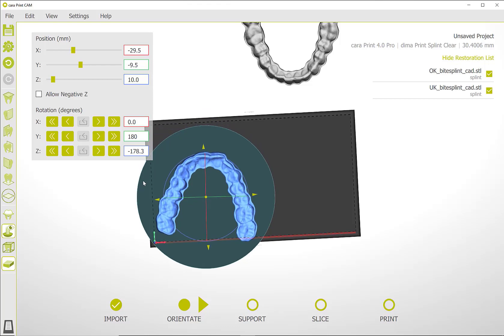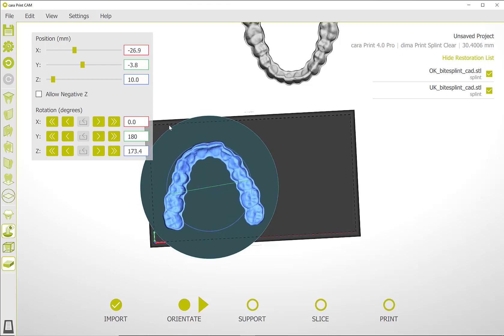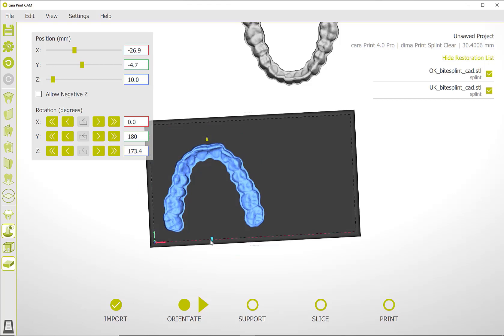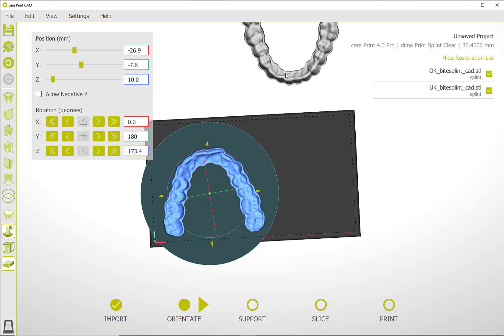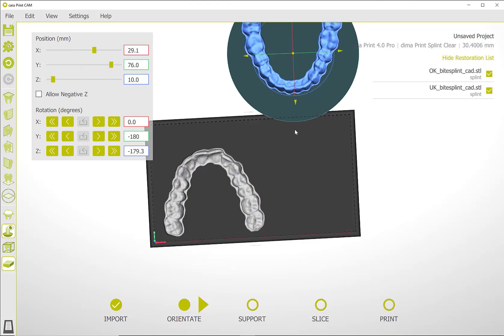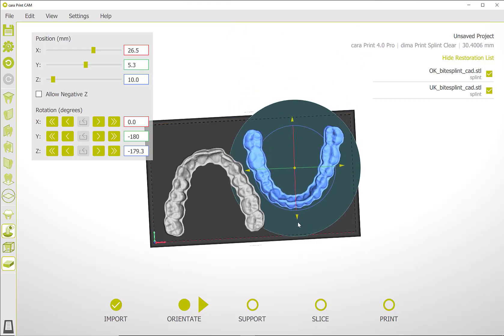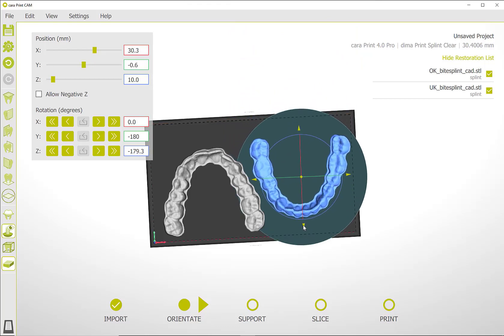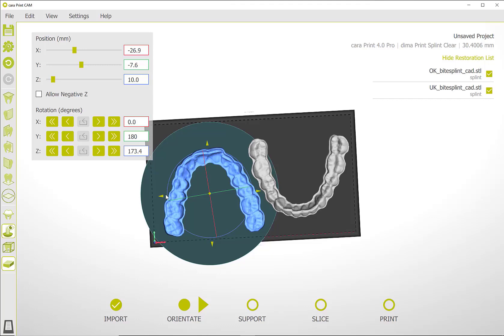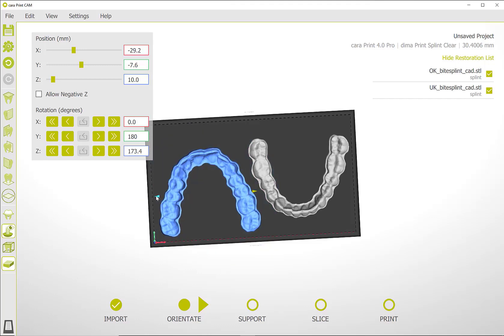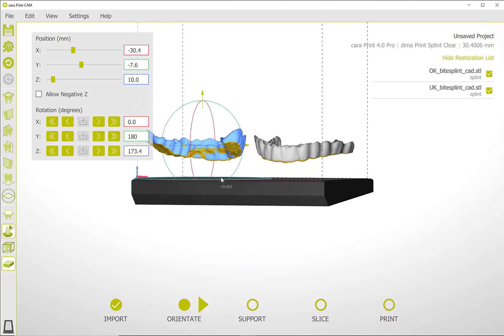Several options can be used to orient the object. To do this, activate an object by clicking on it with the left mouse button. The object is active when it is displayed in blue. Once activated, circles of different colors and green arrows appear around the object. These circles and arrows can be used to move and rotate the object.